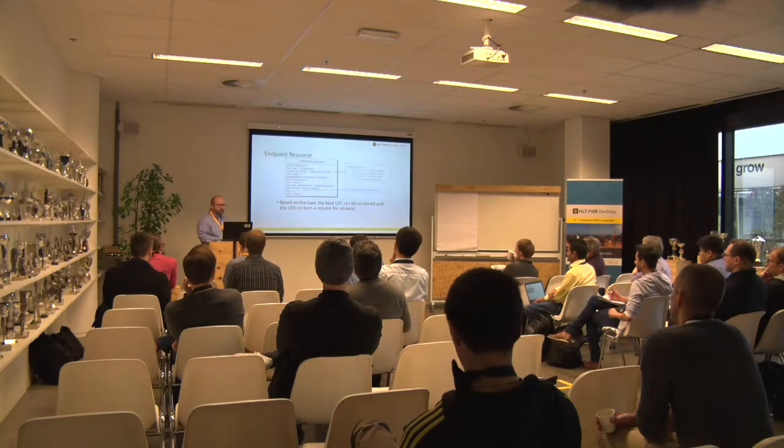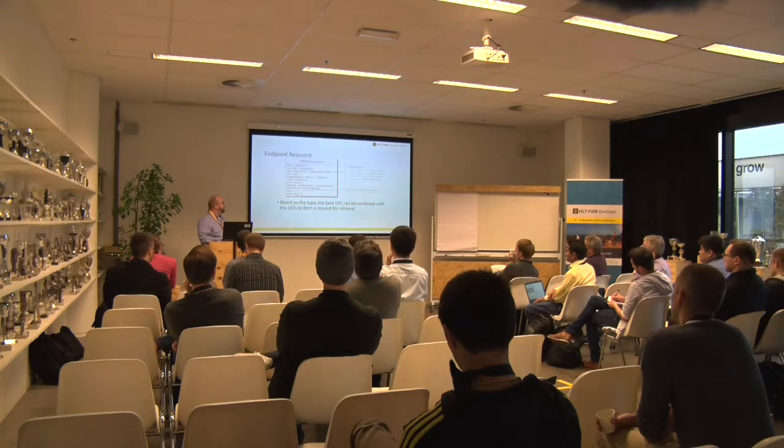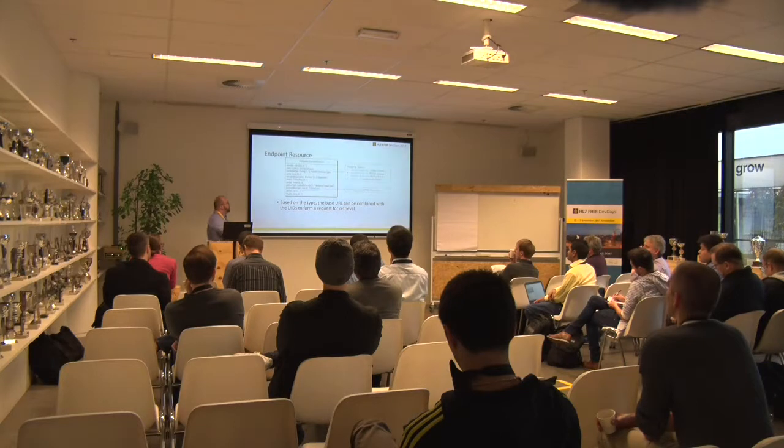Special mention of the endpoint resource. This is our connection between the FHIR and the DICOMweb worlds. This will tell you where to go and get the imaging study. So you can see that we've got the connection type. And there are a number of different types that have been defined.